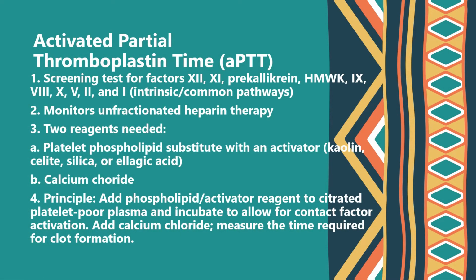The first test is activated partial thromboplastin time, also called APTT. This test is used to monitor for unfractionated heparin therapy and test for the functions of the factors found in the intrinsic and the common pathways.